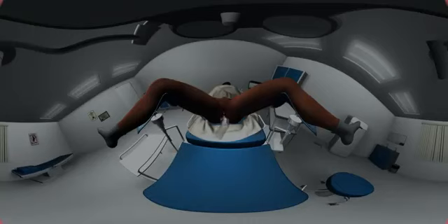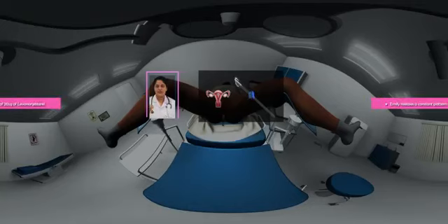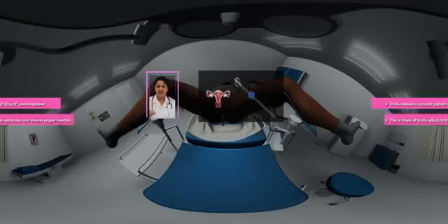EMILY is removed easily by pulling on the threads. EMILY releases a constant amount of 20 micrograms of levonorgestrel over a period of 5 years. The M shape of EMILY adjusts to the uterus size and ensures proper insertion and prevents expulsion and dislocation.